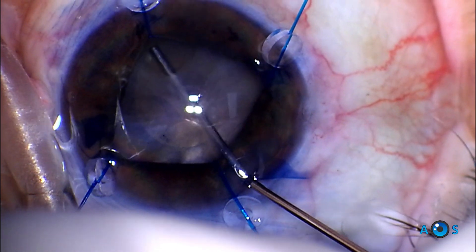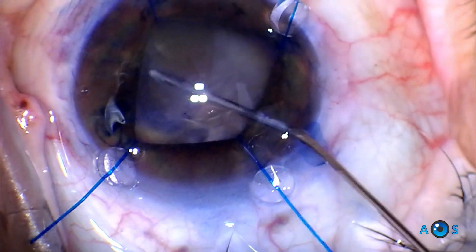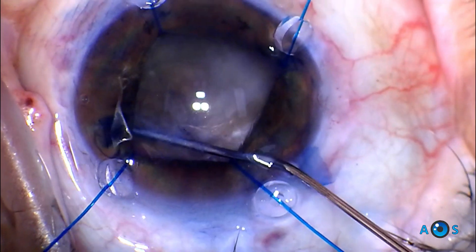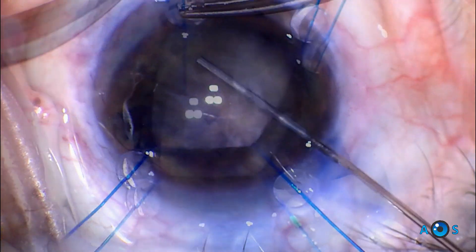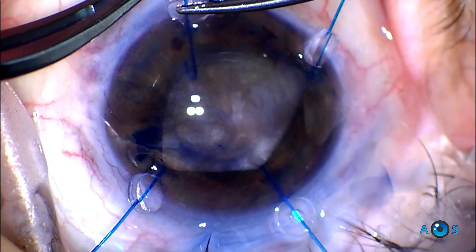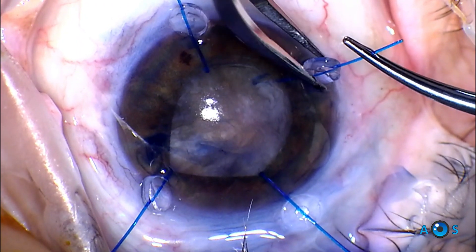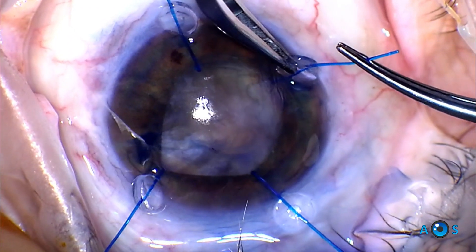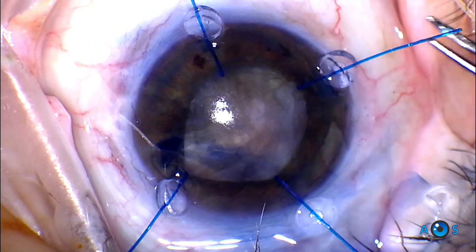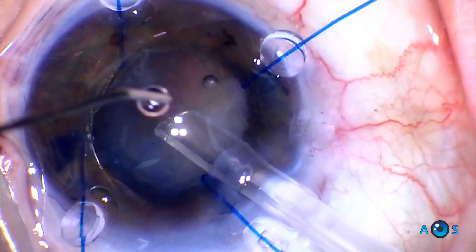Viscoelastic is used to create space between the dense cataract and the capsular bag – this will facilitate placing a capsular tension ring. The inferior iris hooks are moved from the iris plane to instead capture the capsular opening, providing some added support. A capsular tension ring is now carefully deployed under the rhexis using the injector.